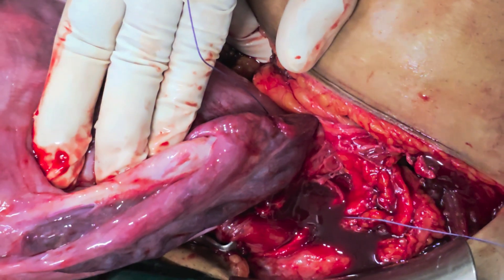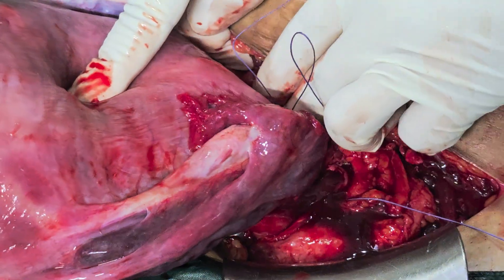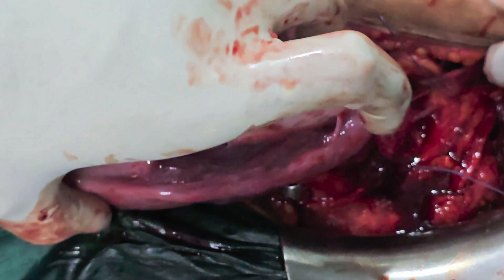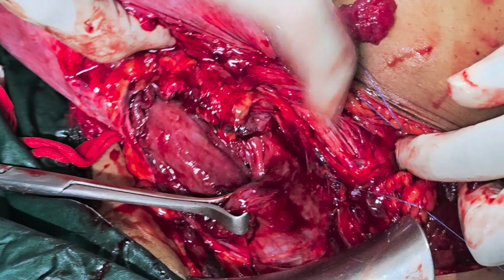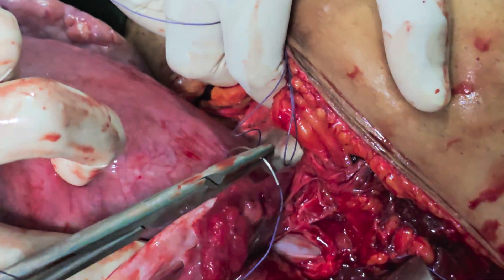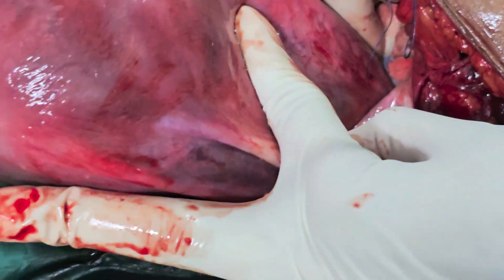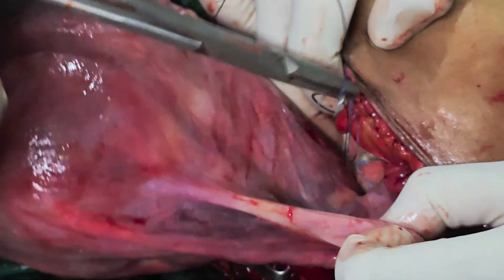The second bite will again come from posteriorly and it will come anteriorly. I am changing the needle now and this suture has to come 2cm above at this point. We are entering from about 2cm above your first entry point. It is always better to use a straight needle here, and that is what has been recommended by Dr. Ashokanand. However, because I do not have a straight needle, I am still using a conventional suture.